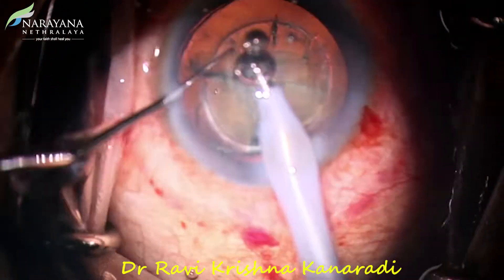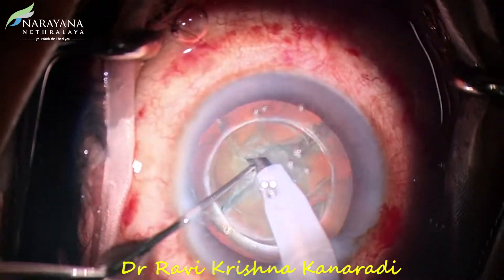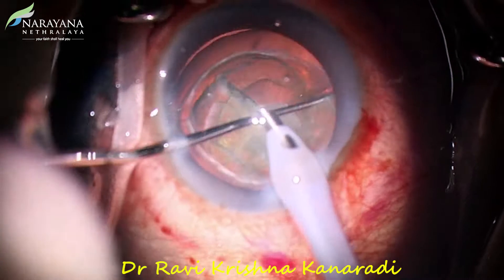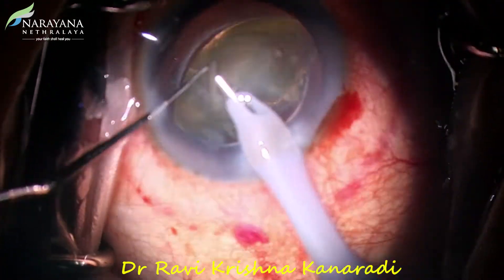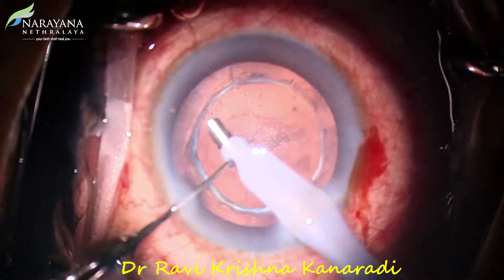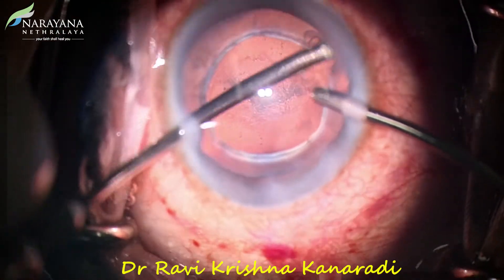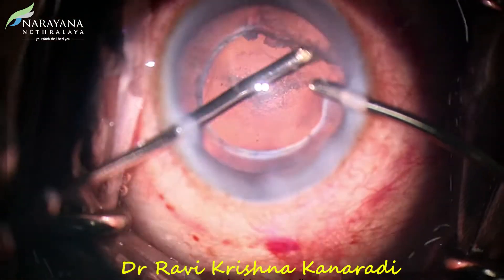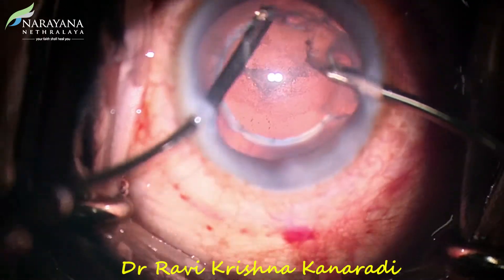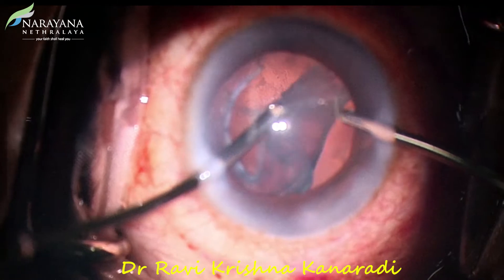Phacoemulsification went uneventfully. After the removal of the nucleus, I noticed a thick epinucleus and cortex shell, and went ahead with the removal of the same using bimanual irrigation and aspiration.